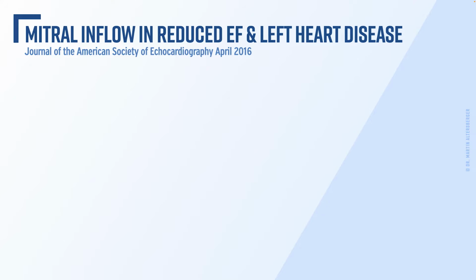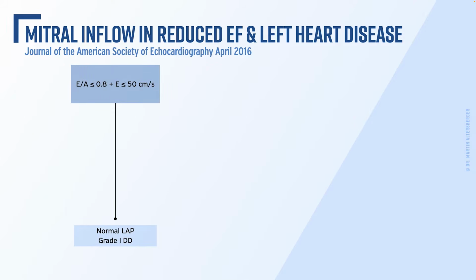The more common situation is especially in patients with a mitral valve inflow in reduced ejection fraction, but also in left heart disease. So if the left ventricle is diseased, we have to think: do we have normal filling pressures or elevated filling pressures? As soon as you have a left heart disease, for me personally, it is a thickening of left ventricular walls, but also dilatation, for example solely in the left ventricle, but also when you have a dilatation of the left atrium, you have to think about whether there is truly a left heart disease present.